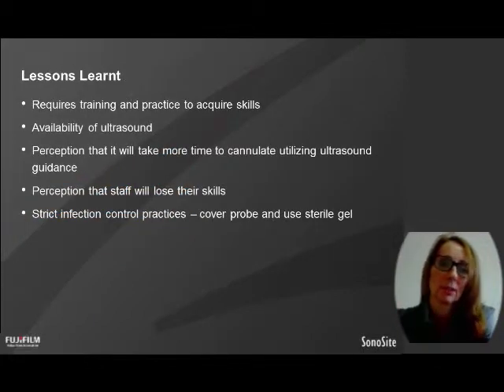Some of the lessons that I've learned with my years of using ultrasound is it requires some training and practice to acquire the skills, but it's really worth investing that time. Unfortunately, in units that I've worked in, when we got the ultrasound, we went on the assumption that we could just continue to be experts and bring in this new skill of ultrasound and just continue cannulating and assessing and have no issues.